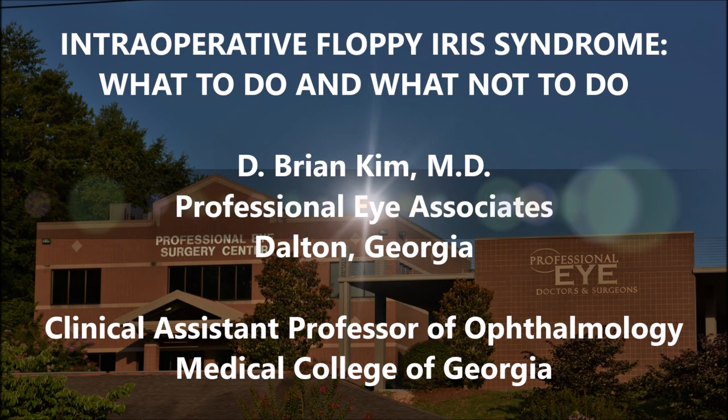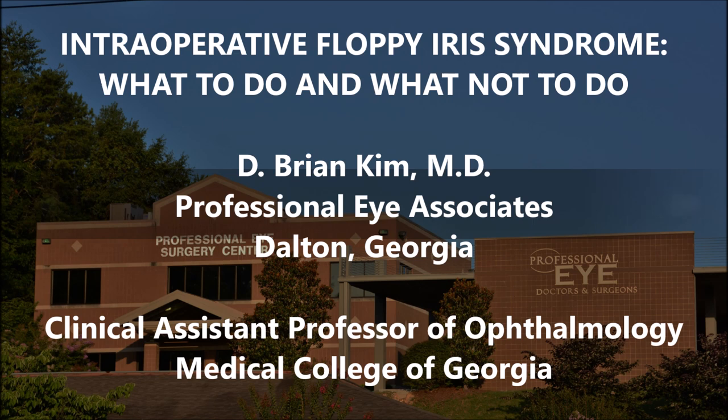Hi, this is Brian Kim. I'd like to share with you this case of intraoperative floppy iris syndrome. Normally, with the history of prostate medication use, we have an idea of a patient needing intracameral epinephrine. Usually these patients have a borderline pupil, but not always. This patient had no history of prostate medication use, and as a result, this was a little bit of a surprise. I'm going to show you this case to point out early signs of the floppy iris syndrome, and also what to do and what not to do.